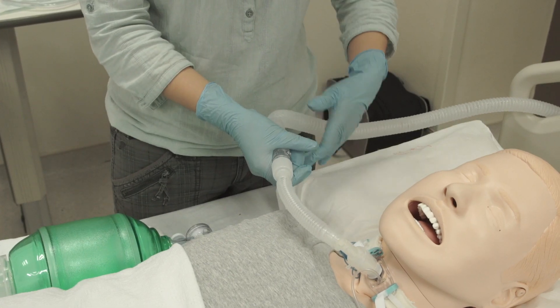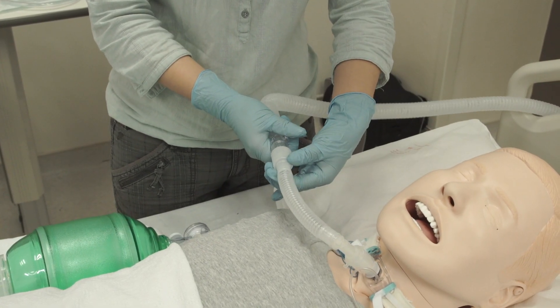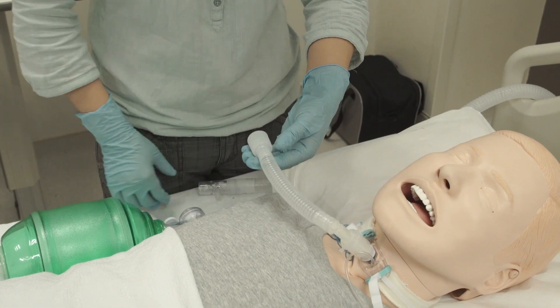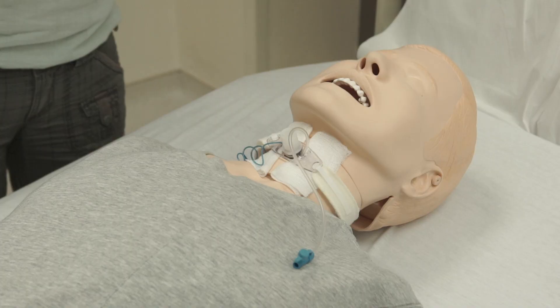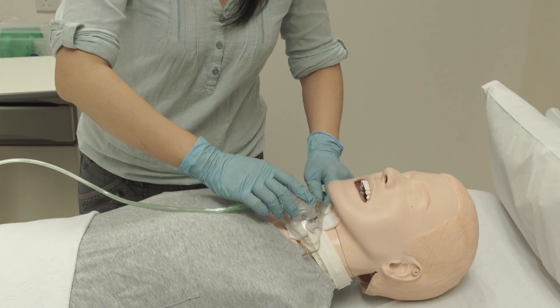If the patient is not dependent on the ventilator, disconnect the ventilator tube and allow the patient to breathe naturally. Give oxygen if needed.